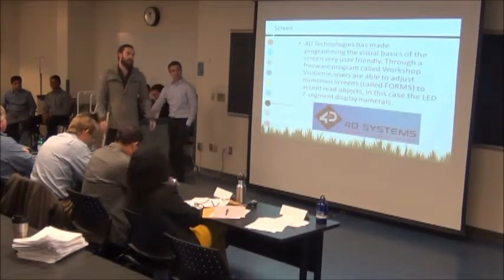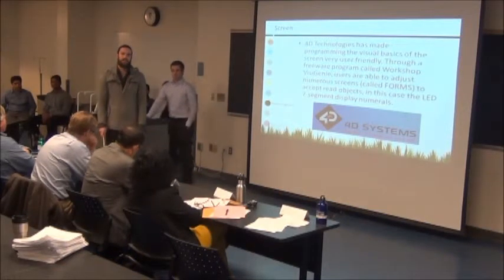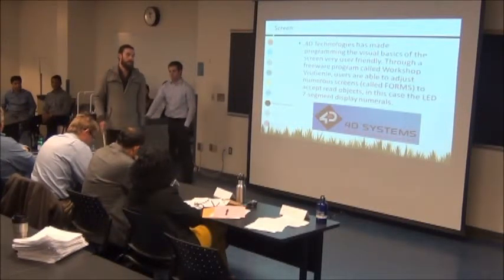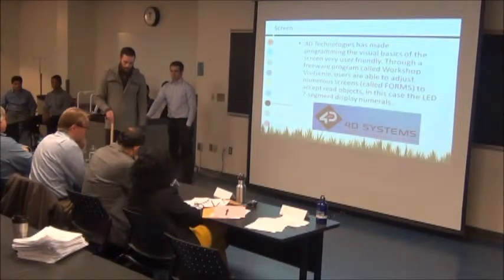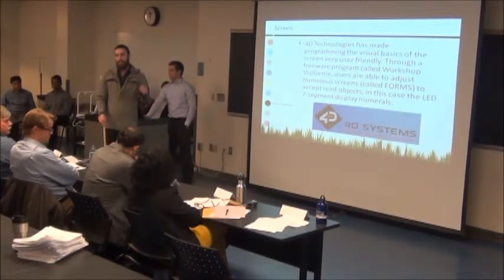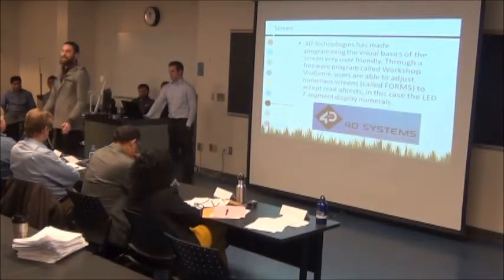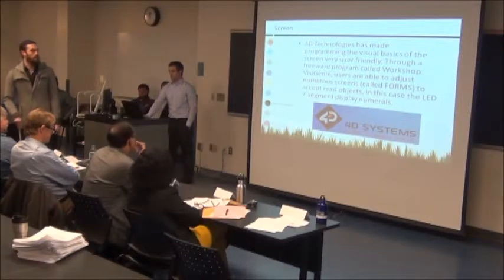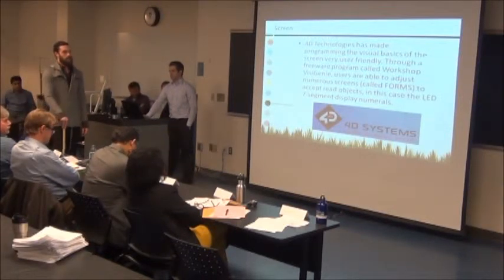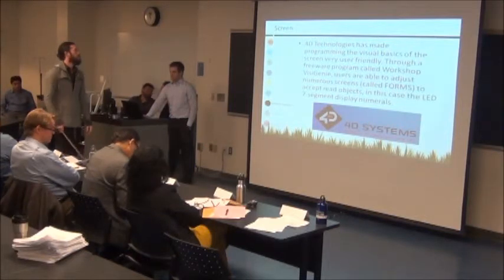I'm guessing in 2 years, if first year students worked on this, there's 7-inch displays available right now, and I think 10 or 12-inch could be available in 2 years, which are all resistive touch, made by 4D Systems. And if that's available to them, I'm sure the whole front panel could be digital. You wouldn't have to worry about knobs and buttons and switches and all these archaic things. So it is good for learning, and it's awesome to apply knowledge, but right now this is what we used, and yeah, you can see the output here. We'll do some demos later with it as well.